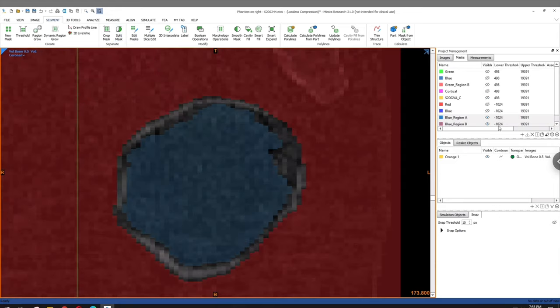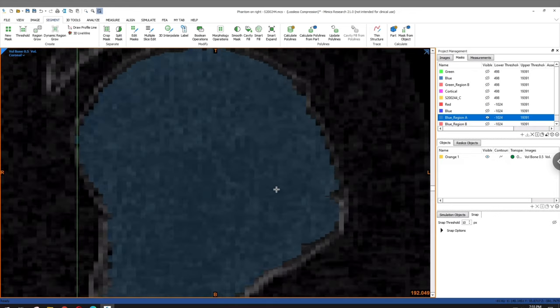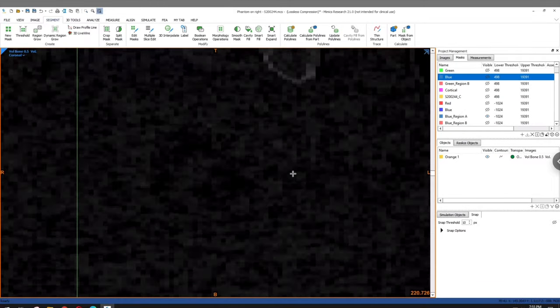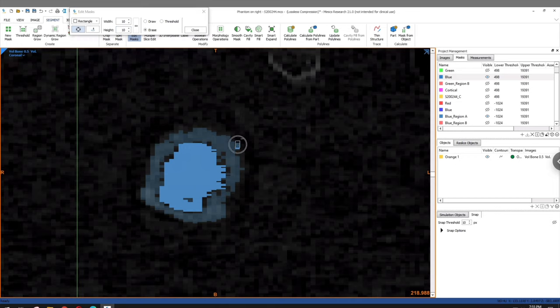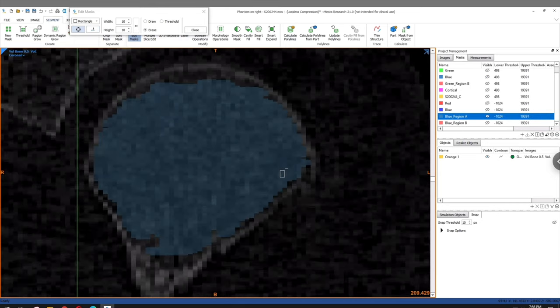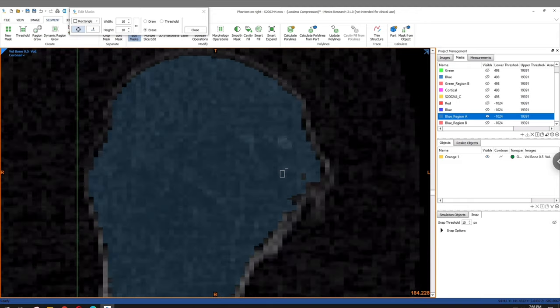So as this operation finishes, you can see me just scrolling through what Mimics has isolated as our trabecular bone, but of course there are going to be some minor errors that you're going to have to touch up yourself. And it's important to do this as you really want two solid bodies for your trabecular and your cortical bone. You don't want to have any unattached little solid bodies that are just floating around outside.